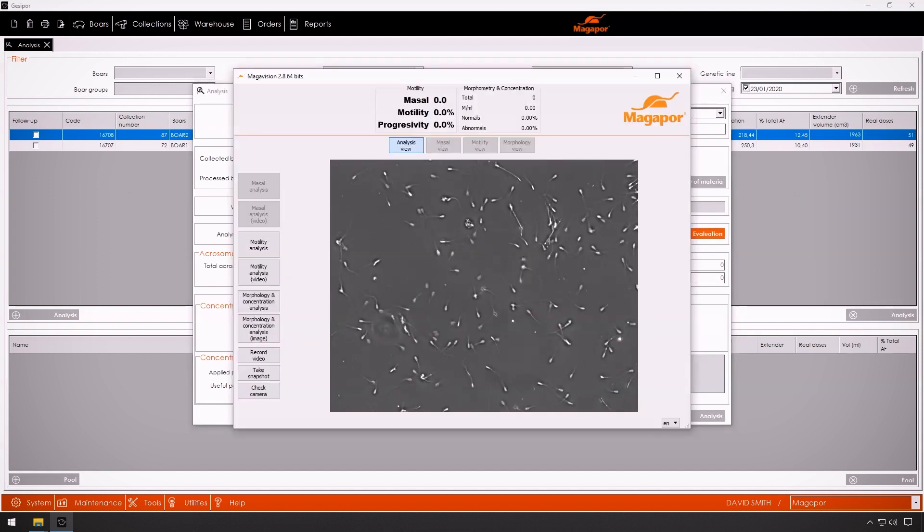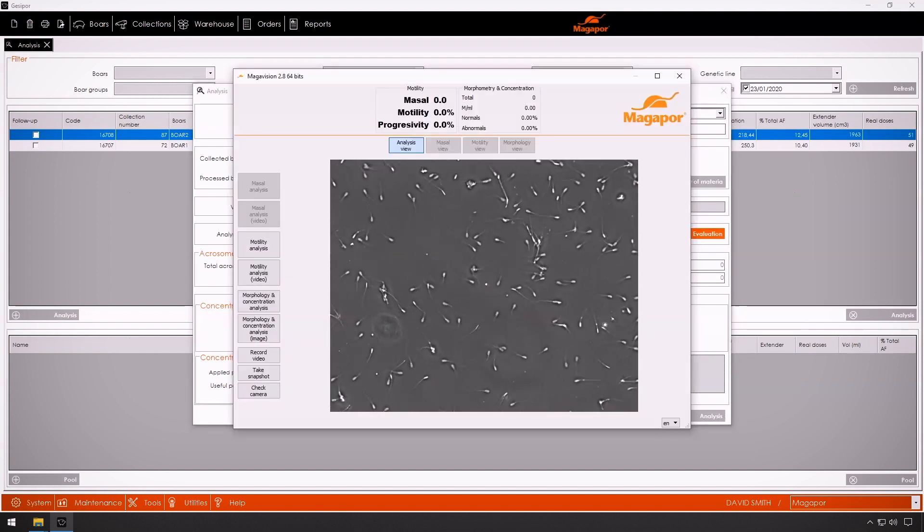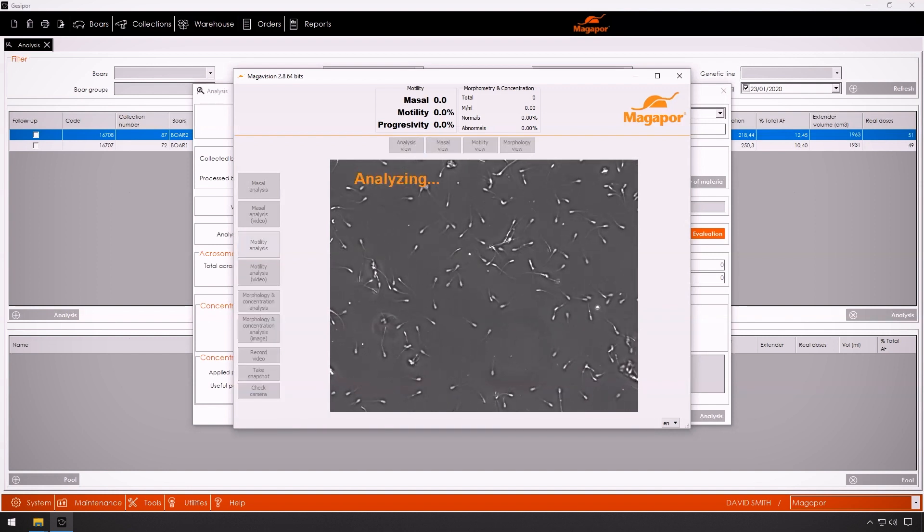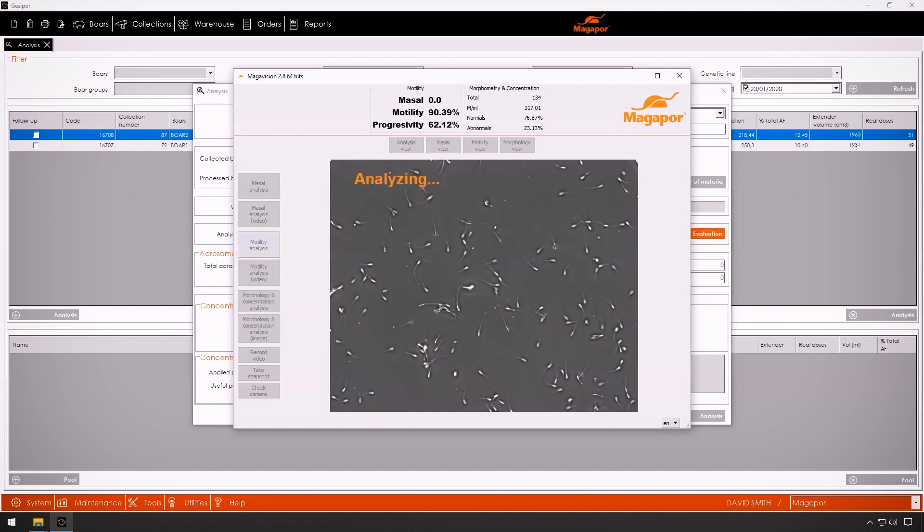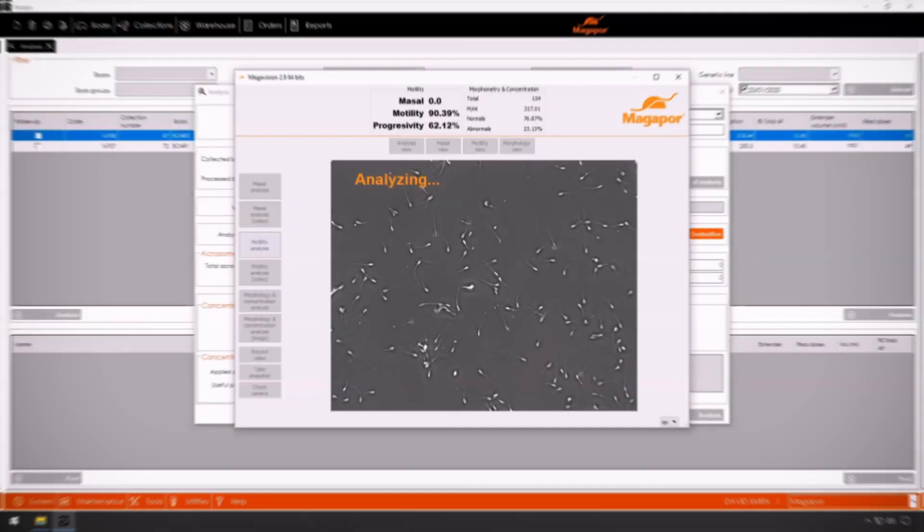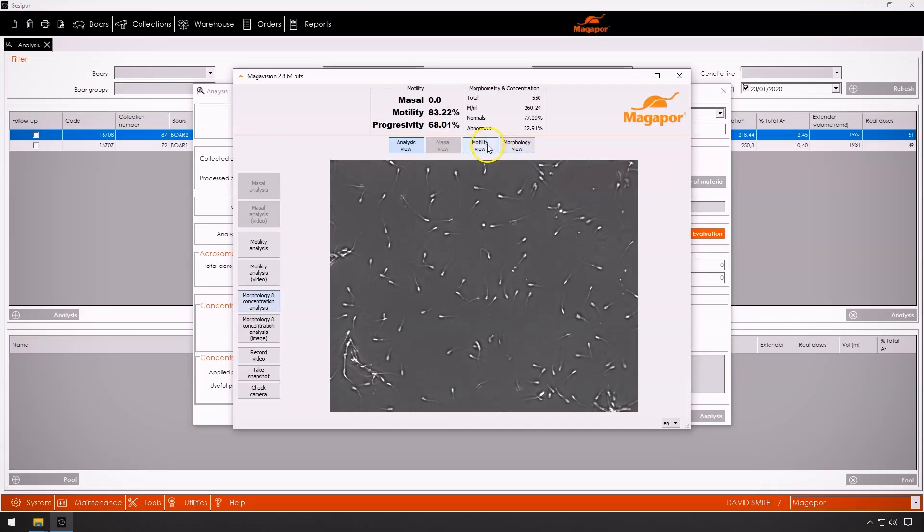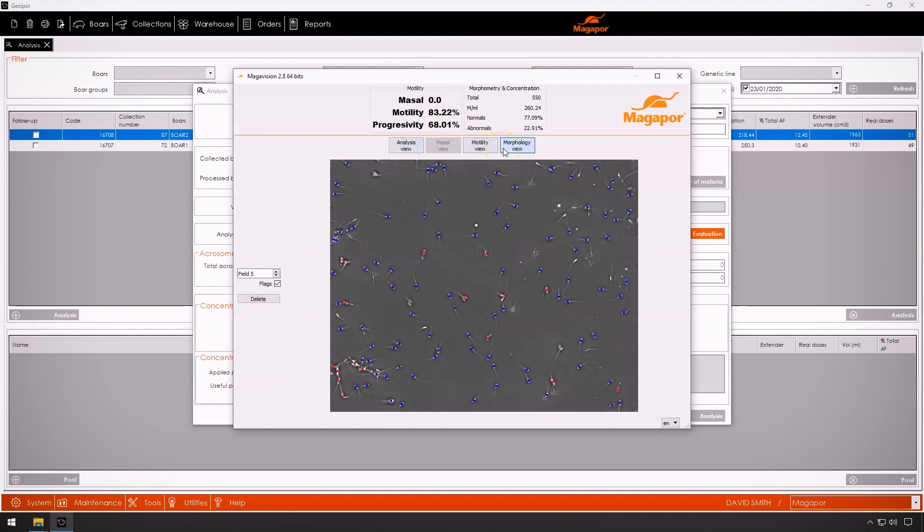This analysis can be carried out using the computer keyboard, capturing five fields or 500 sperm cells to analyze its total and progressive motility, concentration, and morpho anomalies. Magavision identifies sperm with a different color code depending on whether they are motile or not, normal or abnormal.